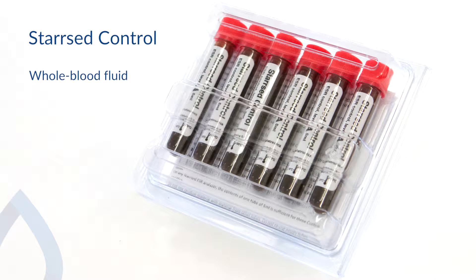Star Z control comes in two versions, each with a different predetermined sedimentation rate that represents either the normal or abnormal level. With those two levels, the RR Mechatronics Quality Control program is truly comprehensive.